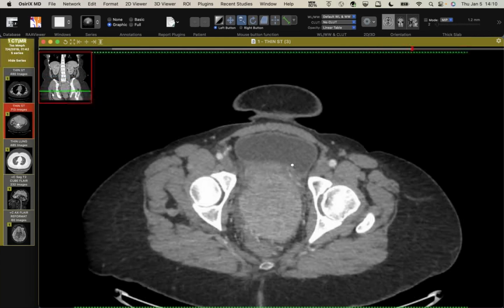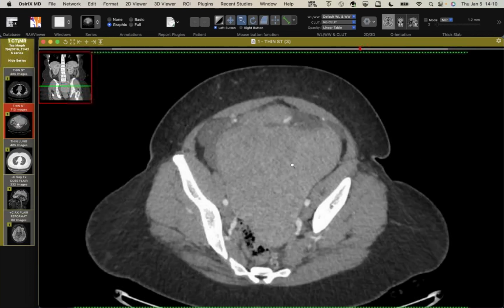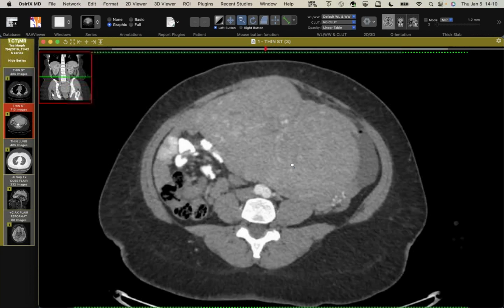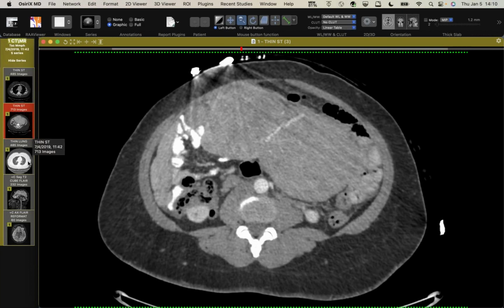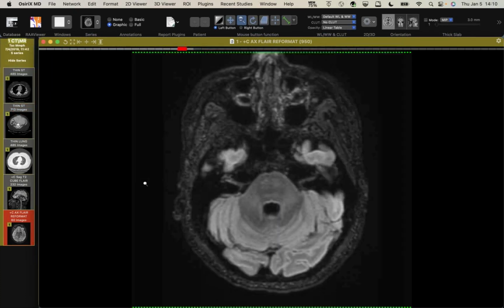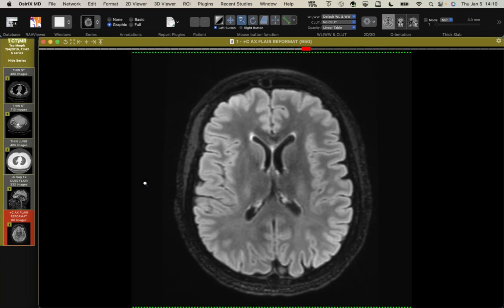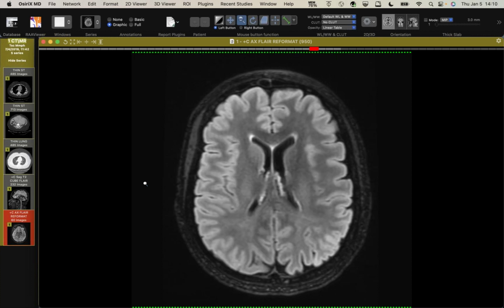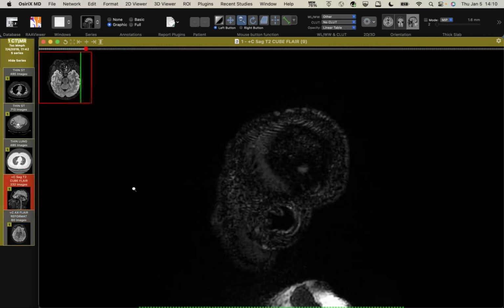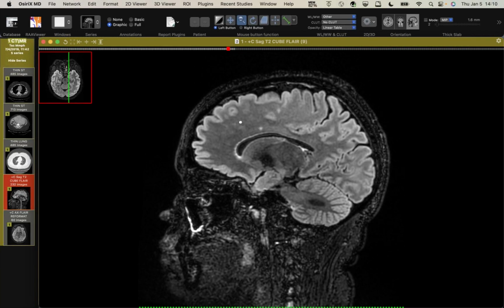And this was biopsied, and these are all tuberous sclerosis related tumors. So not a malignancy here. And then here's her brain just to show you. She's got, let's see if I can see a couple of the abnormalities. Yeah, these little punctate areas here. I think better on the FLAIR. But yeah, there they are, the little tubers, so-called.